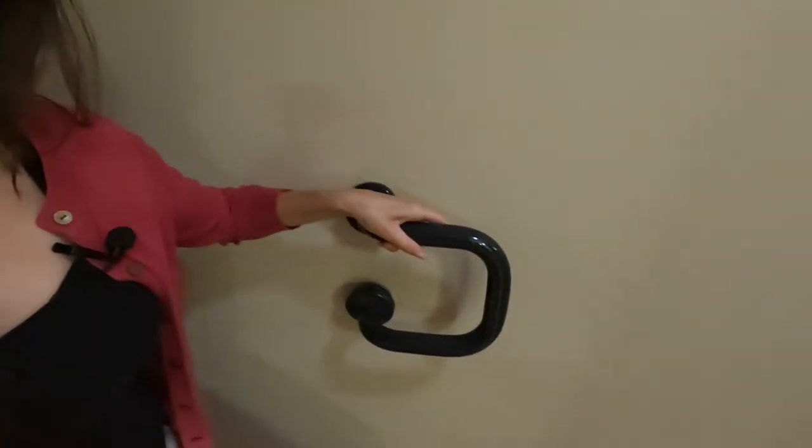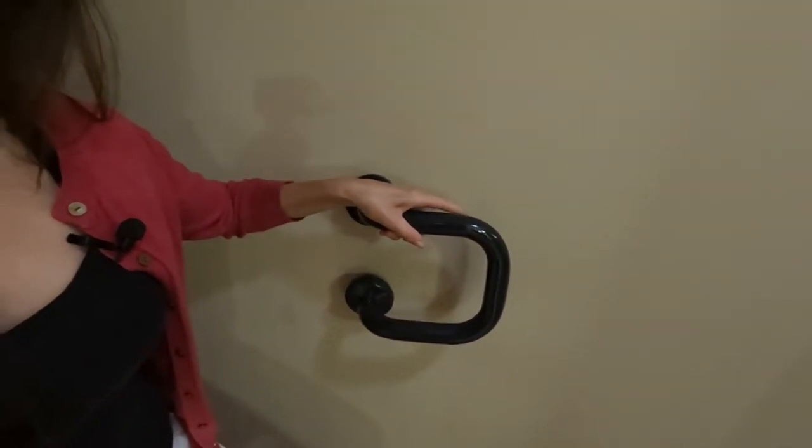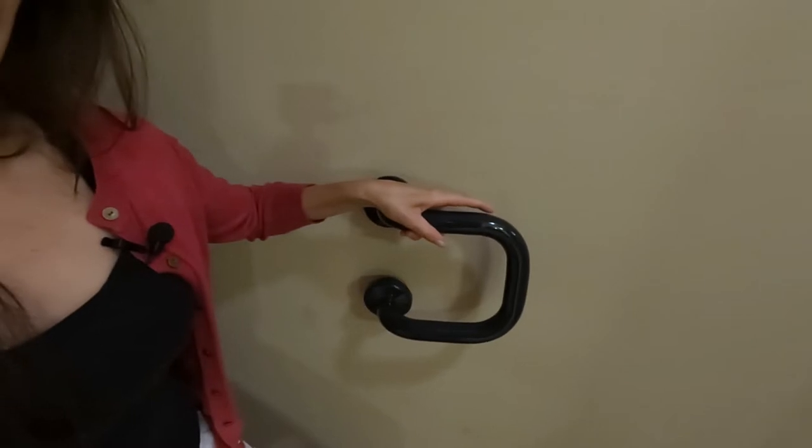I could also turn it around and put it like this so the bottom of the U sticks out forward a little bit, so I could grab onto it and do more of a pulling motion as opposed to a pushing-down motion. That would be a great valid spot for this grab bar. Now we're going to move on to this bathroom's shower!